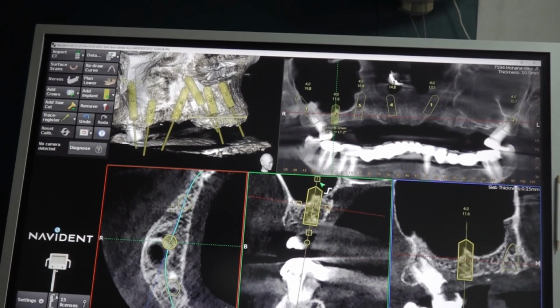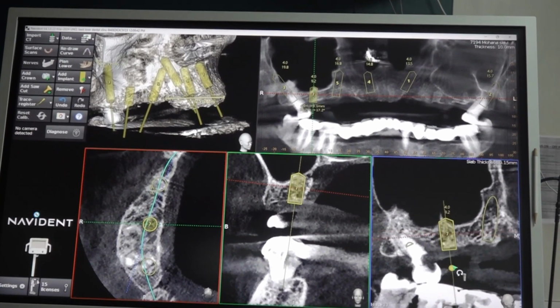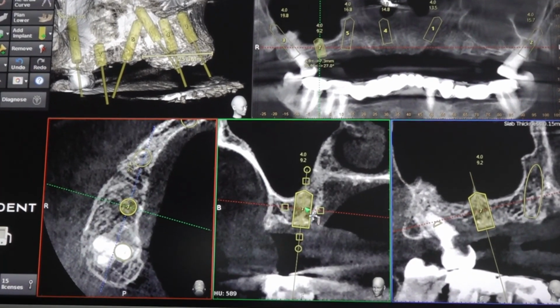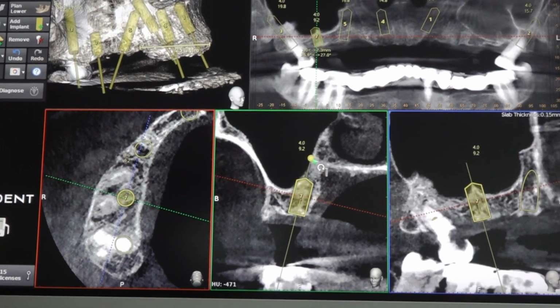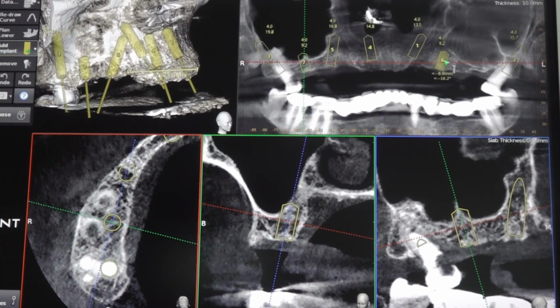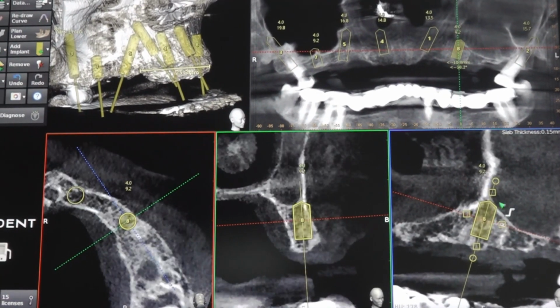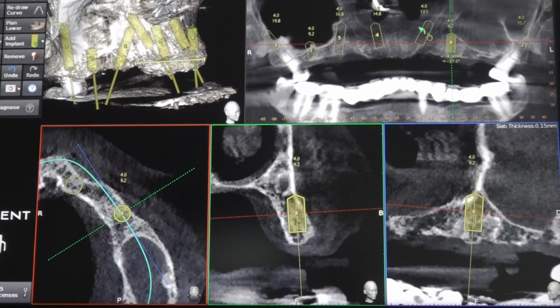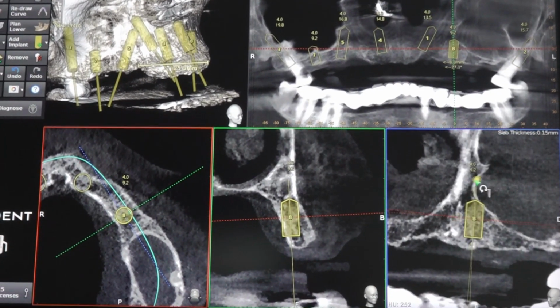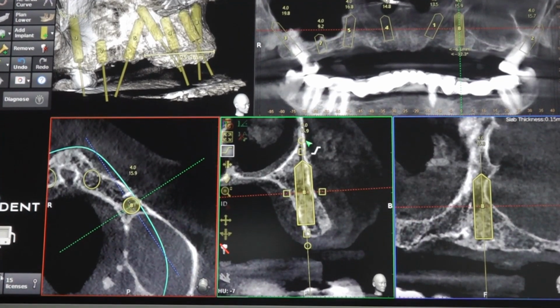The bone is only around 8 mm, but it is not necessary because we have already placed a good pterygoid implant. Okay. Bar? It is bar only. Definitely bar. The left side is more challenging than the right side because the sinus is more dominant. So from the premolar area, we are tilting it and getting engaged in the nasomaxillary buttress area. That's it.